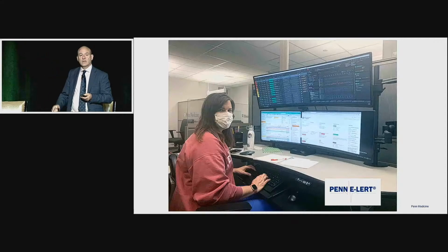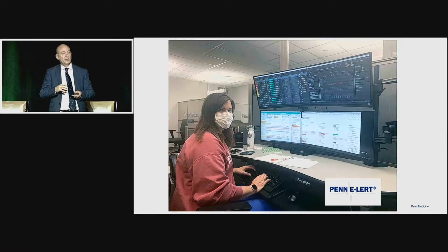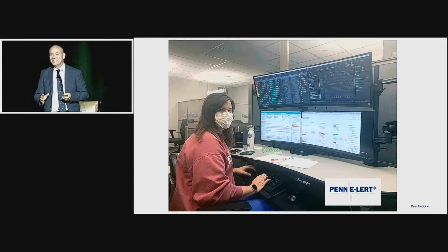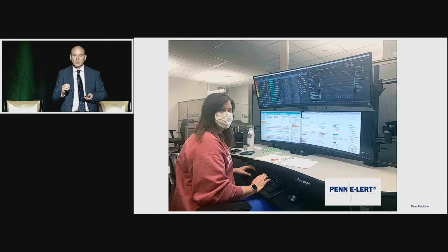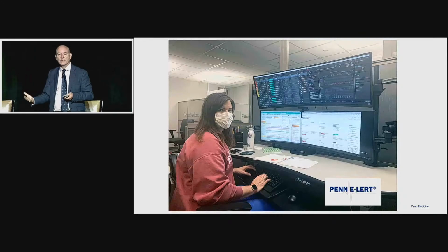The second screen on the top right is a physiological data set for the patient. The reason that is in black is we've built this whole thing in something called Epic Hyperspace on Warp Drive. Now, before you all think I'm a Trekkie, yeah, okay, I did enjoy that when I was a kid, but that's just the term Epic use for running almost a parallel EMR, but it doesn't have the functionality. It's purely a graphical interface, and that's why I took advantage of it, because those of you that know me know that I was a photographer before I went into medicine. I'm a firm believer in graphical interfaces.